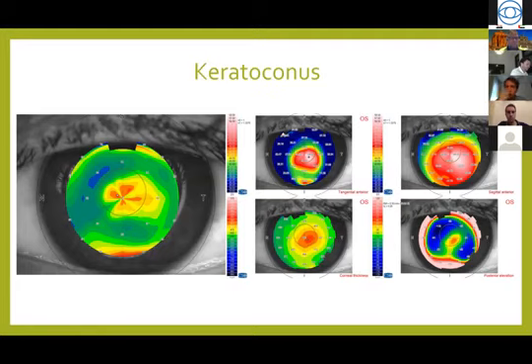And now we're going to see some clinical cases where this epithelial imaging is especially relevant. We have already seen, and probably in the next presentation we will see again, the relevance of epithelial imaging in keratoconus. As Dan Reinstein described, in keratoconus the epithelium thins at the cone and gets thicker surrounding the cone, giving what he described as the donut-shaped image and appearance.